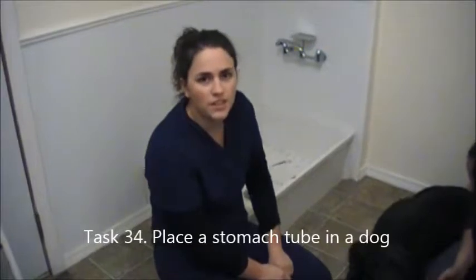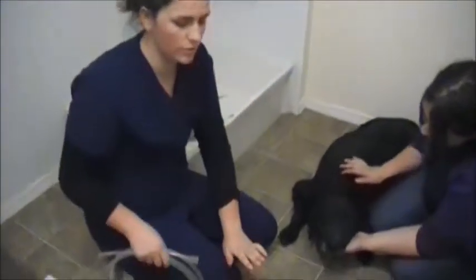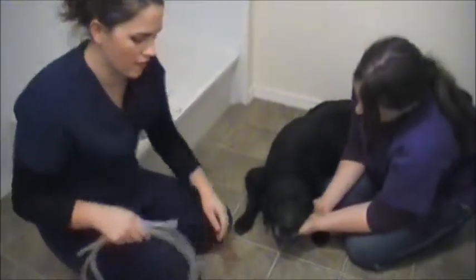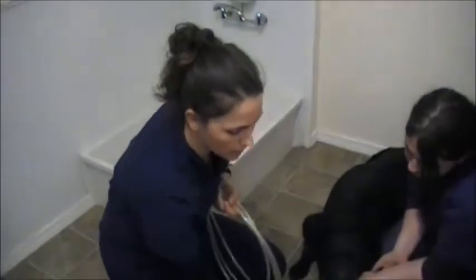Going to simulate placing a stomach tube into a dog. So I've got my supplies here. I've got the tube that I'm going to use, some lubrication for the tube, and then the medication that's going to be passed down in the tube, and a roll of tape to act as a speculum.